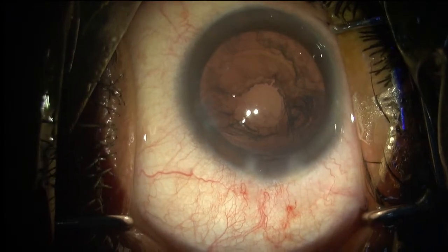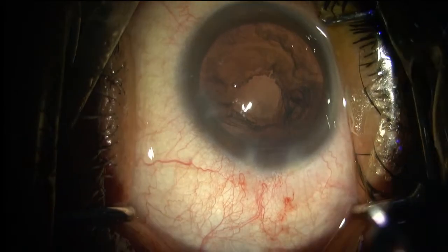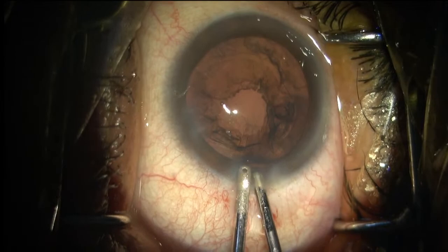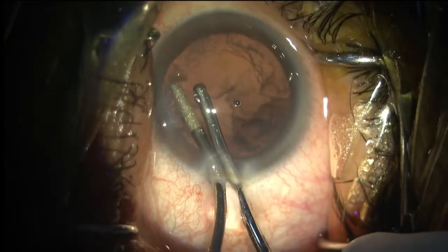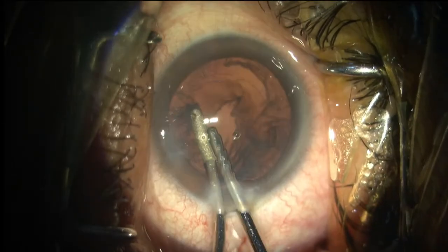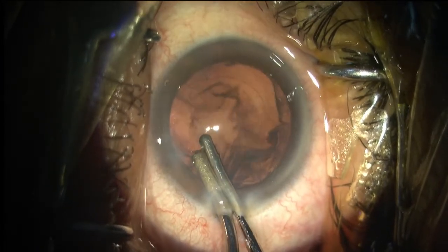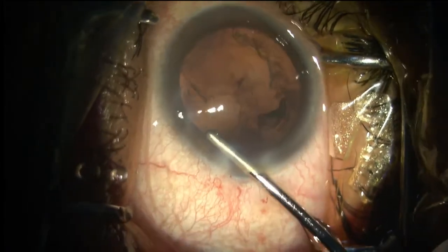So now I use the bimanual technique without having two bimanual incisions. So I use the main port as one of these, and the only problem is the sub-incisional side port. You can remove from the same, but then you'll have to turn the tip down, which may cause distortion of the wound.